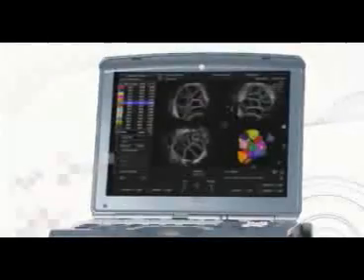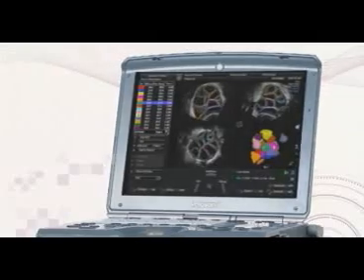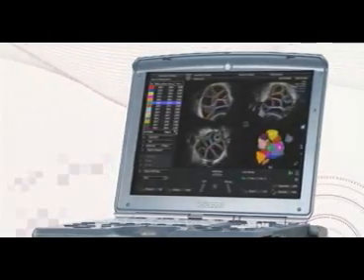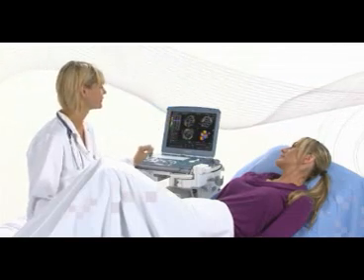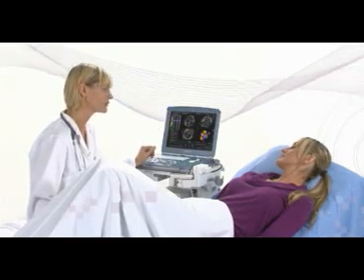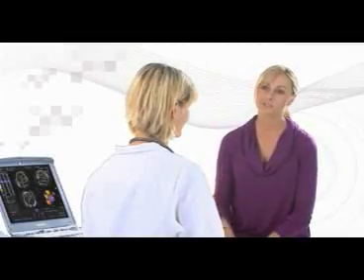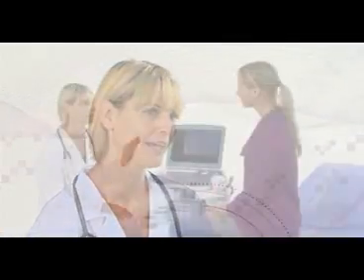Reports display a user-defined follicular size range. SONO AVC Follicle will help to standardize exam procedures within your practice and serves as a clear visual tool for communicating with your patients.